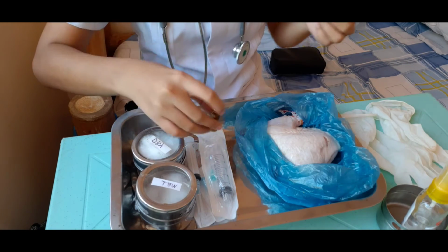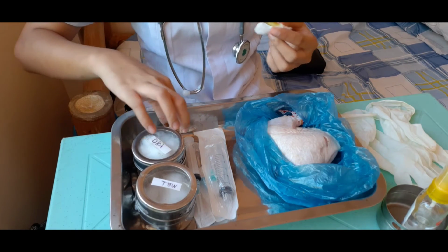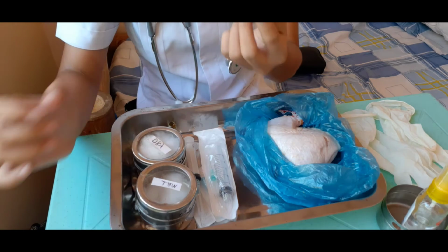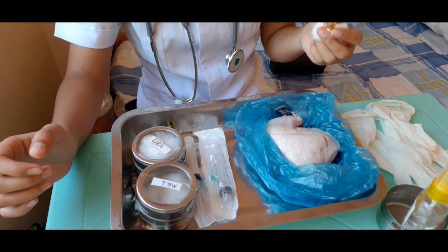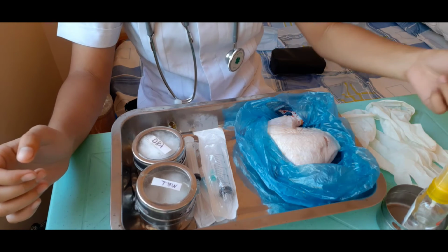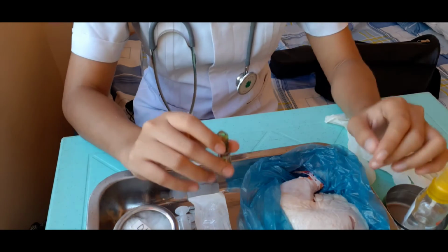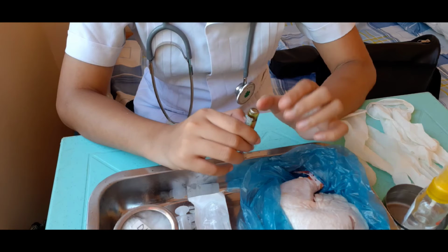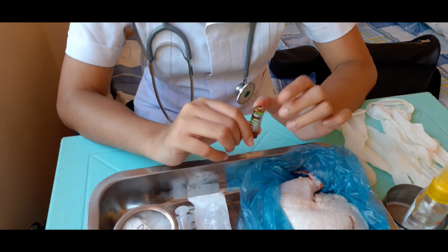Now, we're going to proceed with withdrawing the medication from the ampule. We will discard the broken neck and place it in the container for sharp edges. Alright, so now I am done taking off the neck of our patient's ampule.